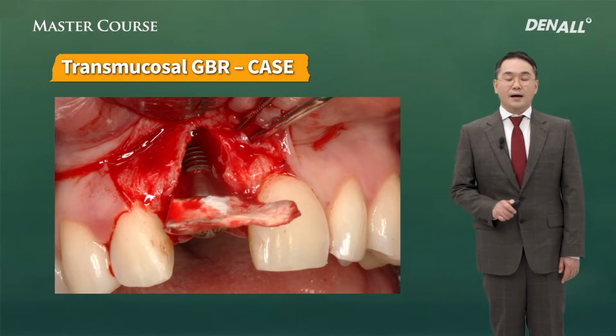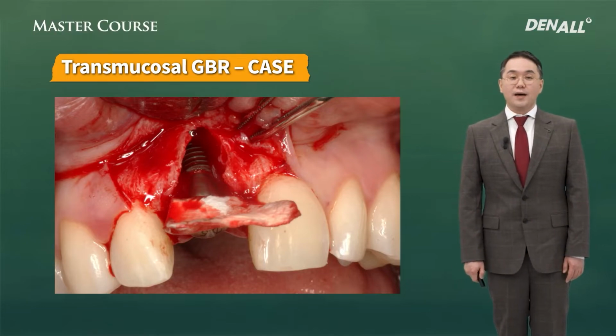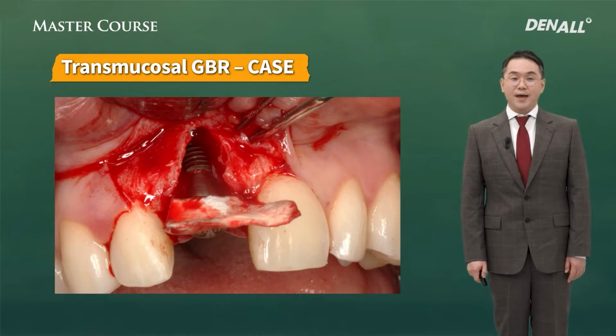After that, as I said before, the OSSTEM collagen membrane is trimmed and holes are made so that a healing abutment can be connected. So it is connected.